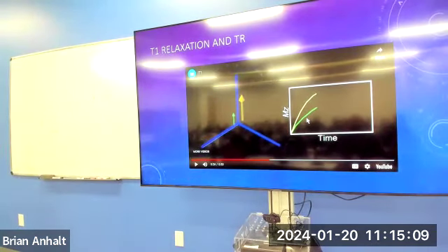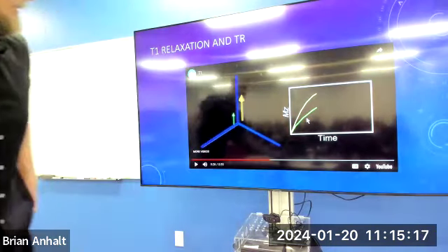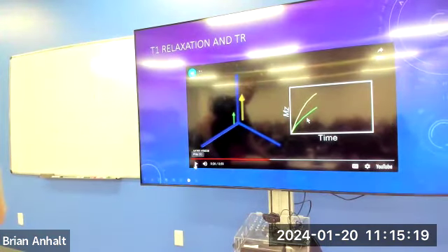Yellow's fat because it recovered quicker longitudinally, right? Now, if we flip them back into the transverse plane before this fully recovers, he doesn't have the graphic here, but I'll let him continue to speak.